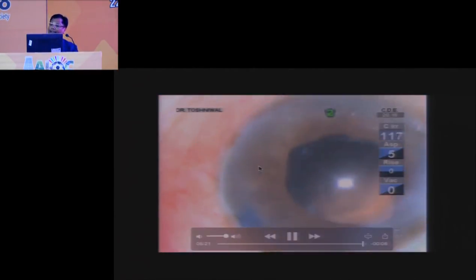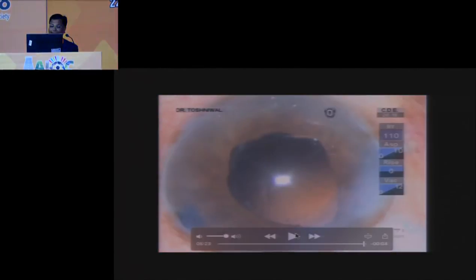Many times you can see here suddenly the iris has come towards the pupillary area. So that indicates that the anterior chamber was really very shallow, and keeping watch on iris behavior throughout the process in a shallow anterior chamber is very important, because iris prolapse is very common. In this situation I have done a limbal incision to control the iris perfectly, and these are the important things.